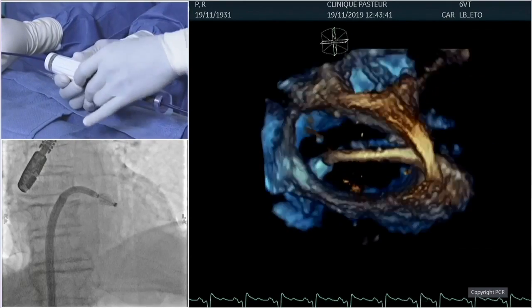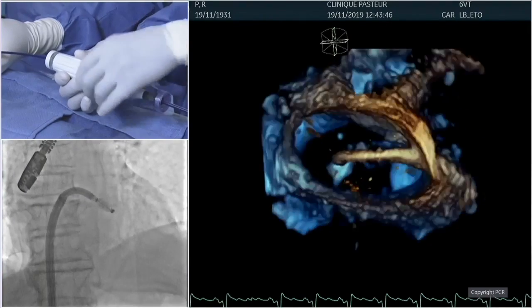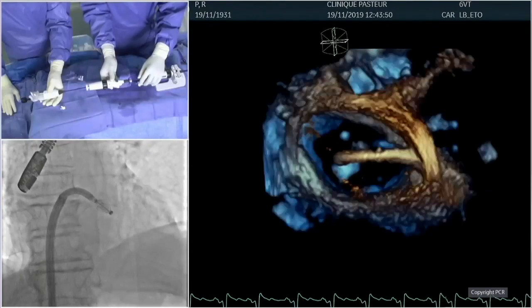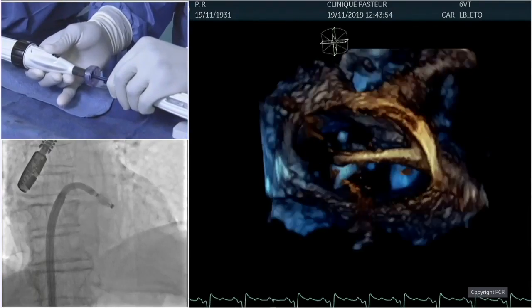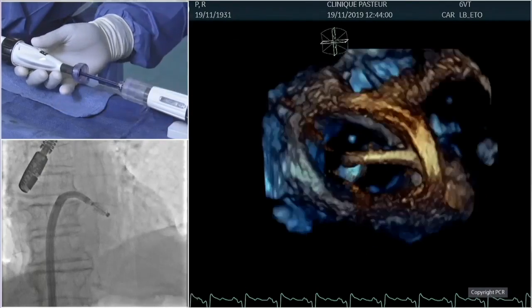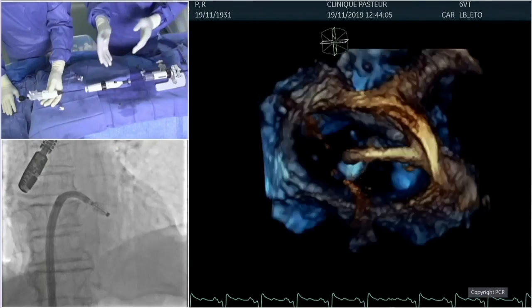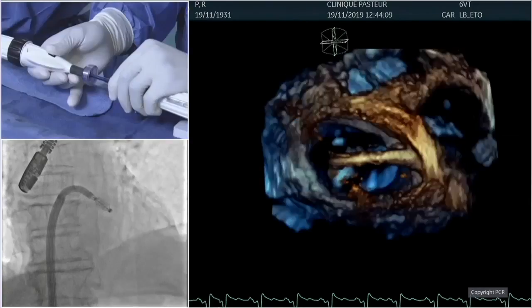We're going to go now to what could be, and we're going to test that afterwards, our perpendicular trajectory towards the mitral valve. And by doing so, the other option, assuming that we're perpendicular, if we want to go lateral, we just have to push the IC inward. You see, going lateral, or pull the IC to be more medial. So now that we've done that, I guess, Nicolas, it's time to make sure that we are perpendicular and that we are pointing towards the mitral valve. So I'm going to push a little bit more.